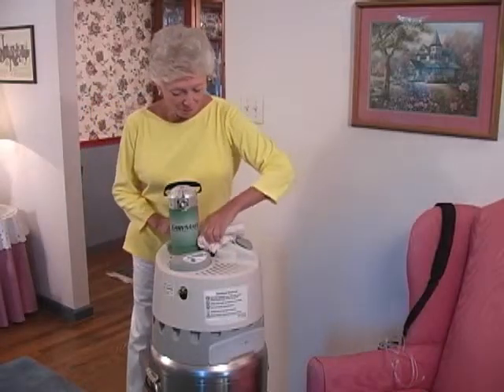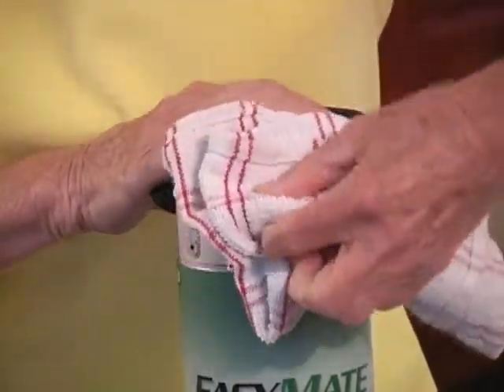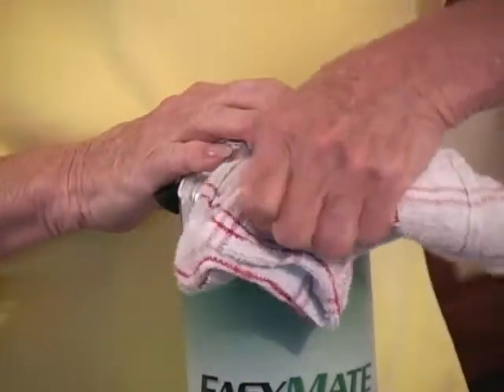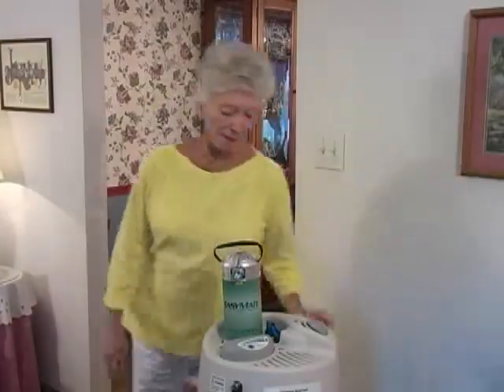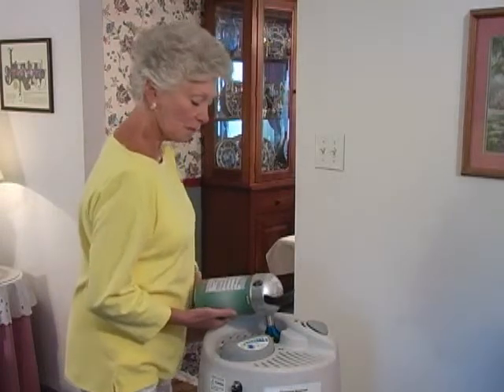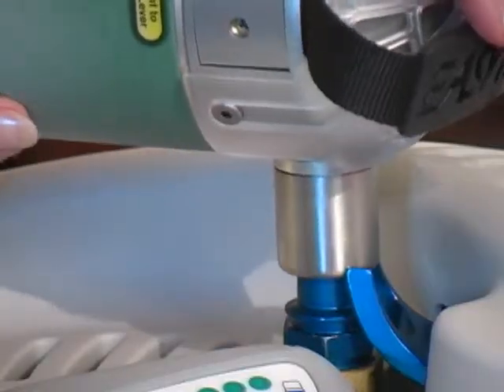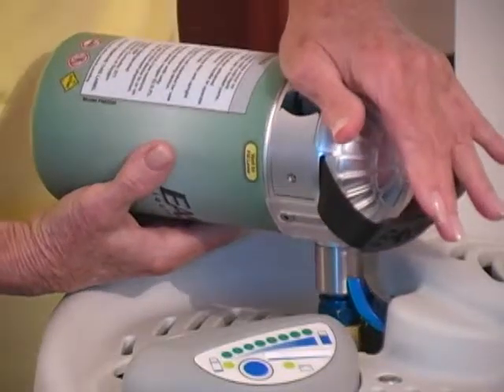To prevent freezing, wipe the fill connectors on the reservoir and portable unit with a clean, dry cloth. Position the portable unit on the reservoir, carefully lining up the fill connectors.